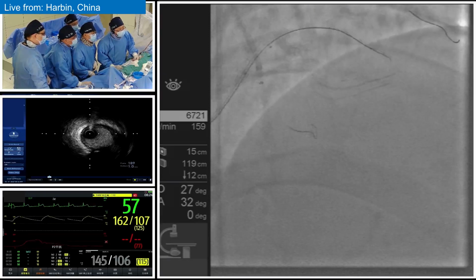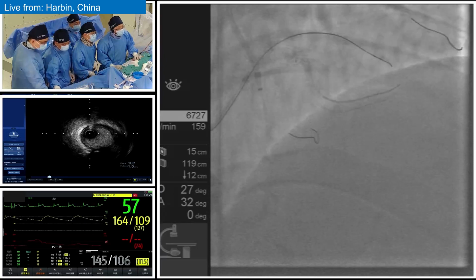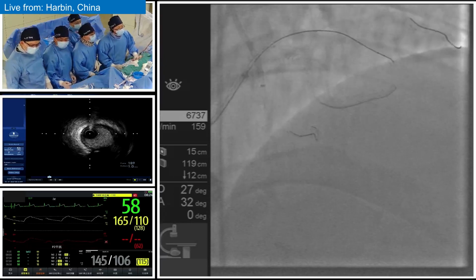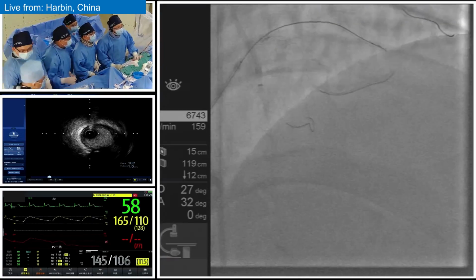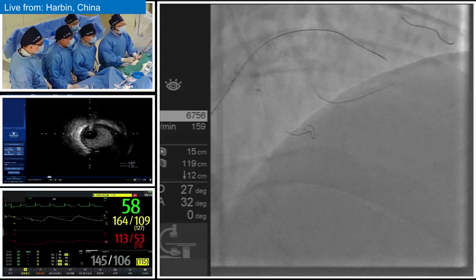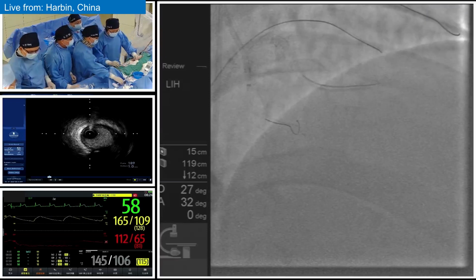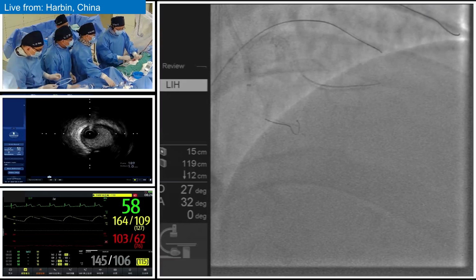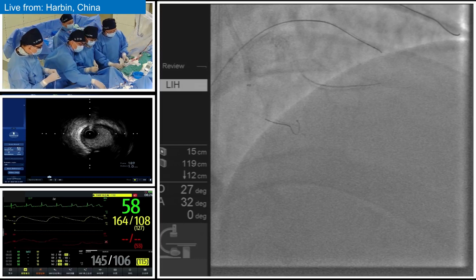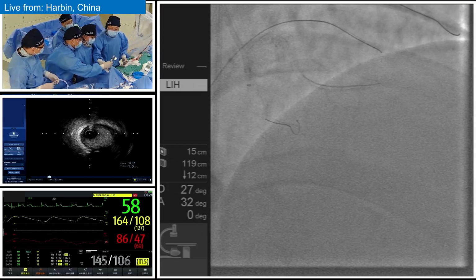The second thing is that we can see the antegrade knuckle technique successfully goes to the distal part of the occluded segment, very next to the distal cap. And also, why we do not try to perform the Crossboss catheter to engage the distal part of the CTO segment.